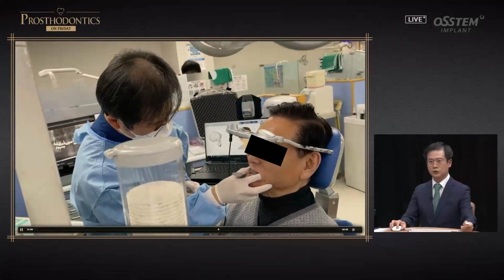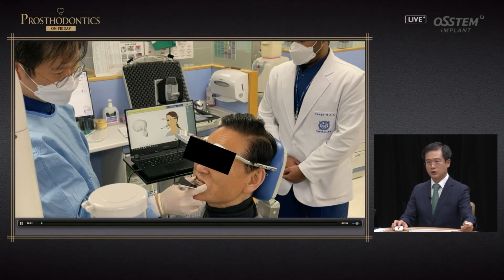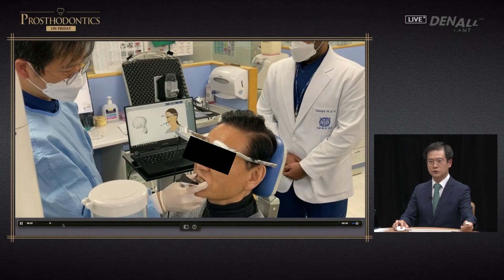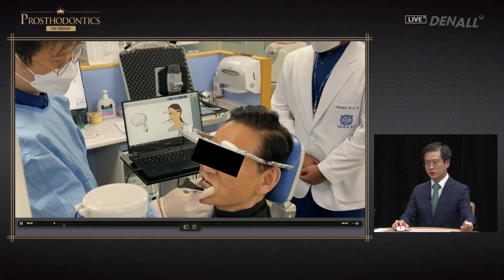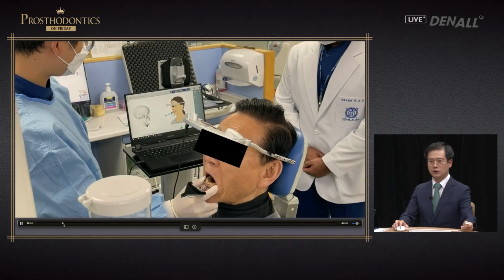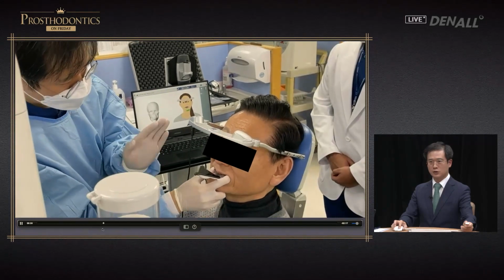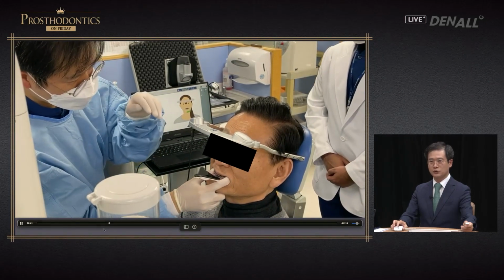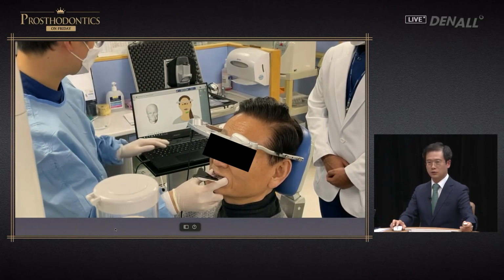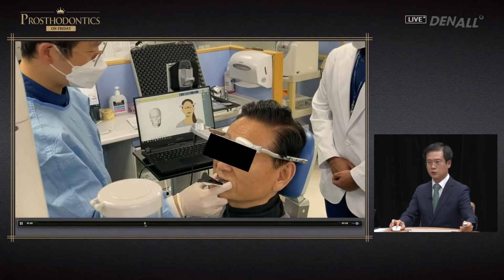Anteroposterior movement is recorded. What is important is that before you have the patient wear the huge appliance, you need to prepare the patient, because once the patient wears this, he or she may feel nervous. Anteroposterior movement, opening and closing of the mouth, and excursive movements. You need to prepare your patient for this before you put on this appliance. In order to get natural movements, different movements are recorded. Opening and closing mouth.